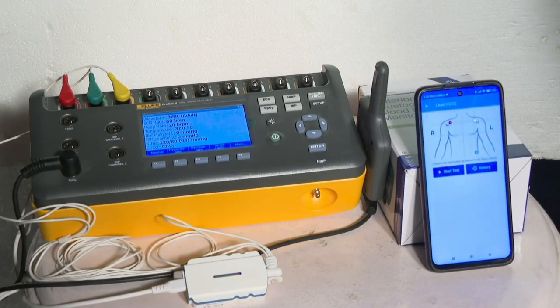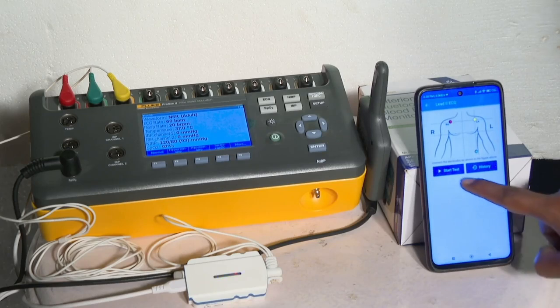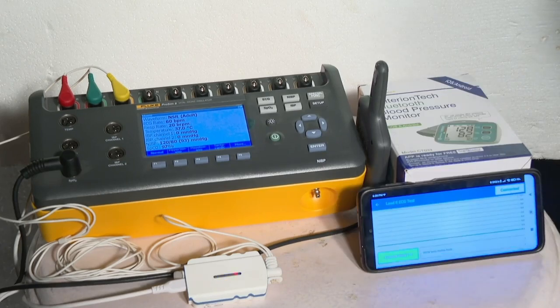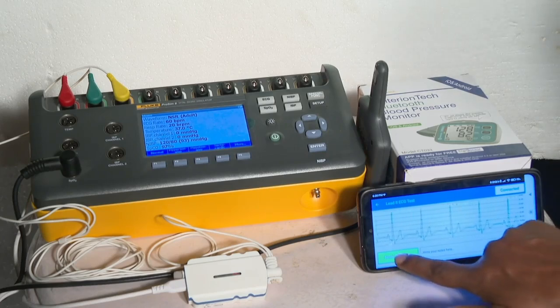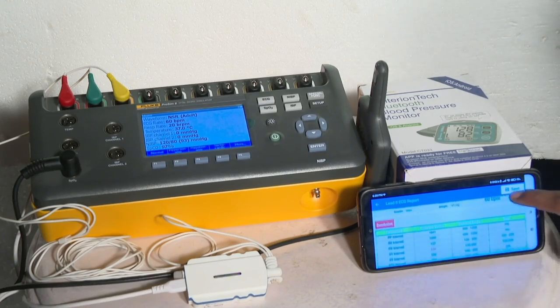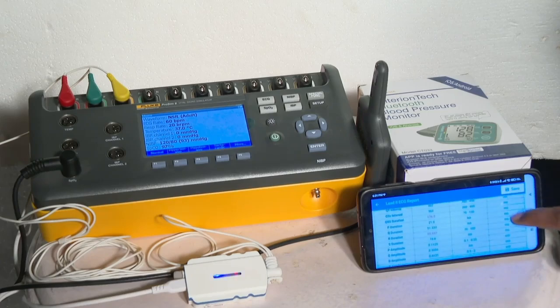I click on start, and where to keep these? There are points where we have to keep them, with color coding. We have to place them there, and then to start the test, we have to click connect. When it is connected, you see this ECG is coming and now you can generate the report. You can send the report either to the dashboard or directly share it to WhatsApp or any media, whichever you want.